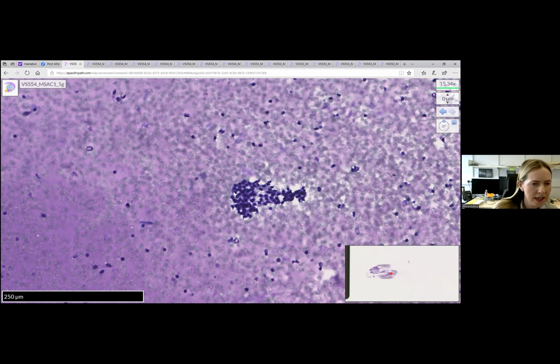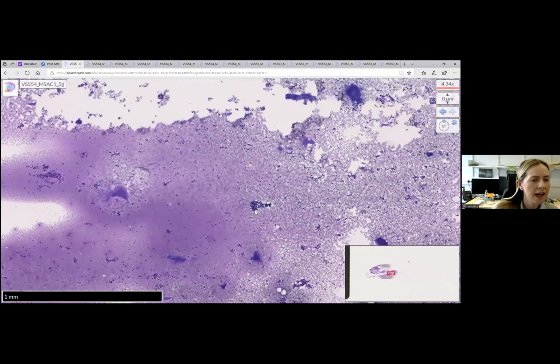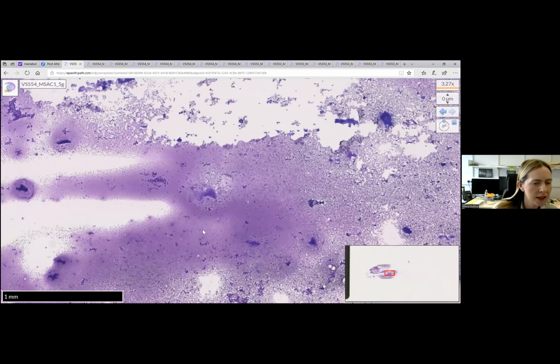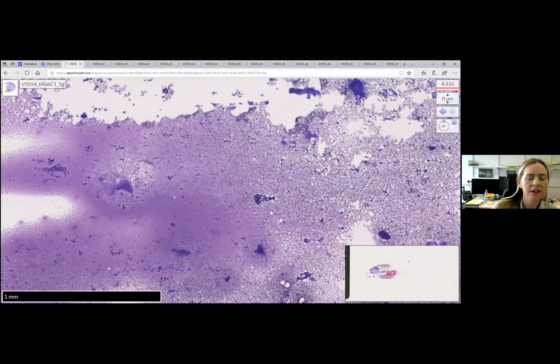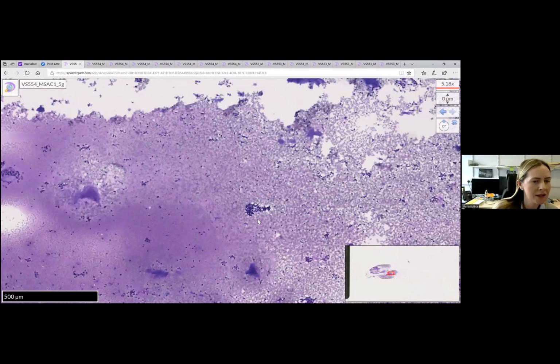And we can see here that they're in benign sheets, they're not forming microfollicles that would suggest a neoplastic process. And we saw similar features in the PAP. I suppose for the purpose of the exam, a pertinent negative would be that there are no nuclear features of PTC, and your bottom line would be a benign Thy 2 non-neoplastic nodule. Any questions?